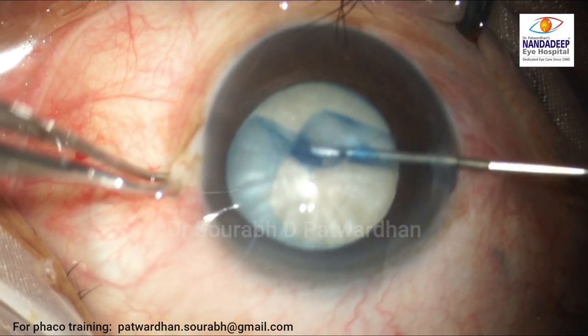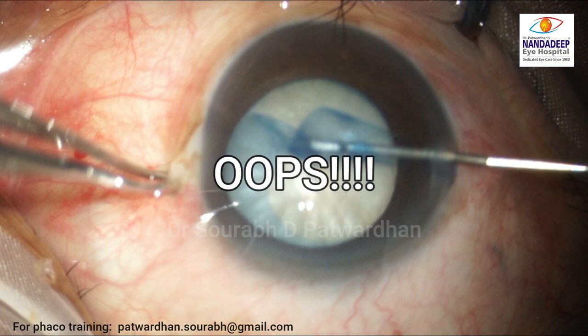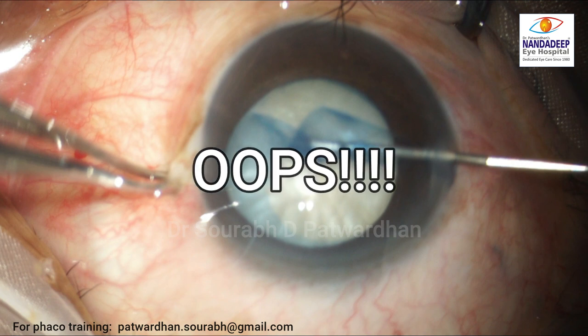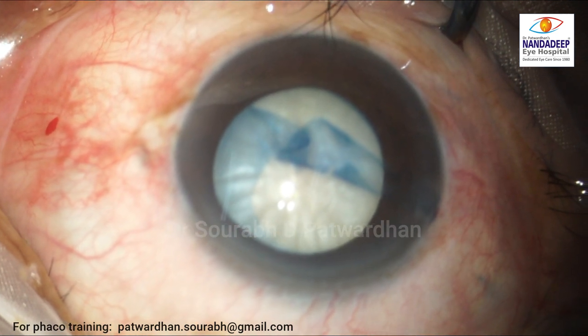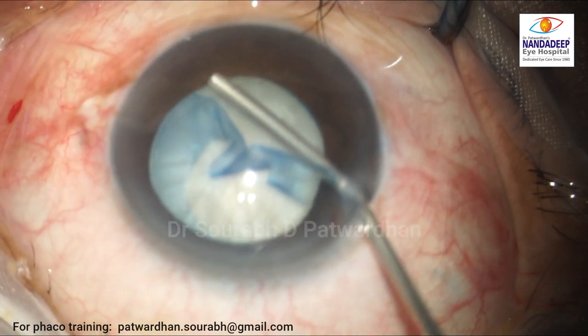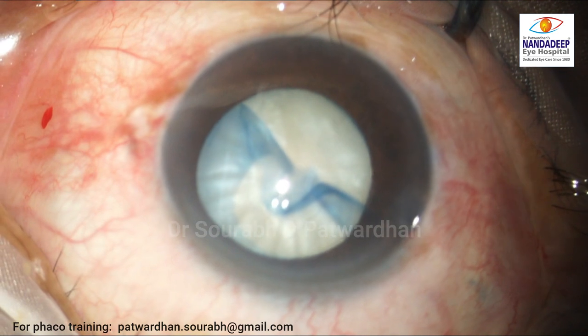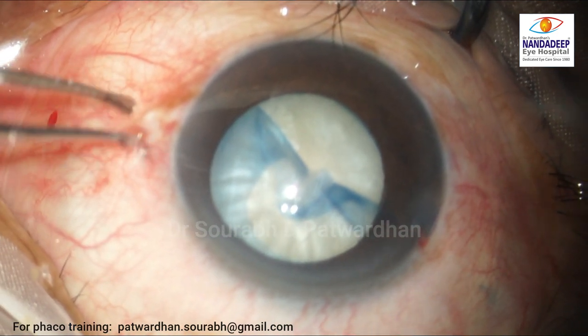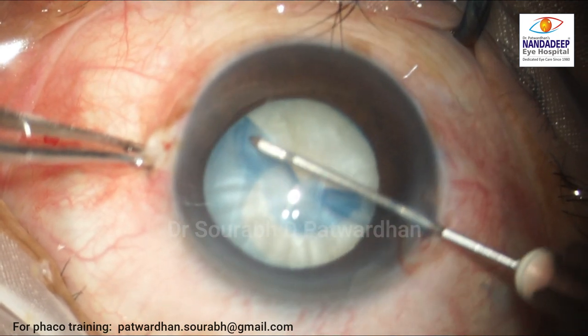Because the margin hits an intumescence fluid pocket and the rhexis tries to run away again. The surgeon realizes this and again fills the anterior chamber with methylcellulose — a good technique: go beyond the rhexis margin and then push the viscoelastic so as to flatten the capsule.